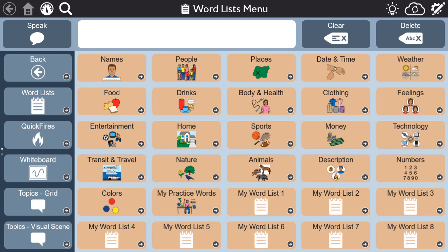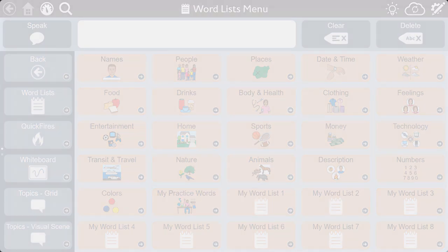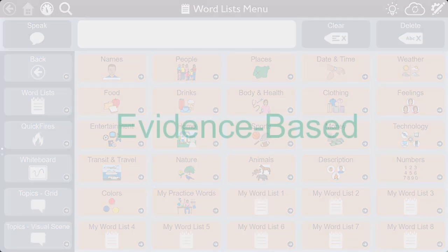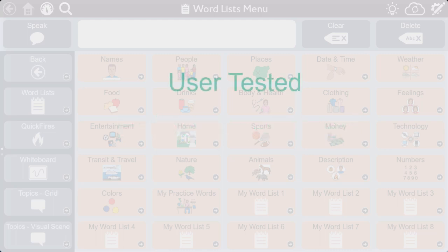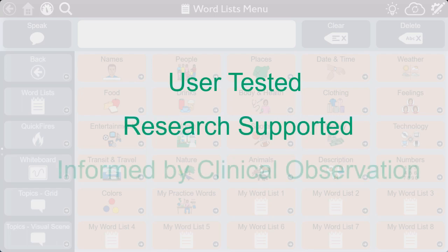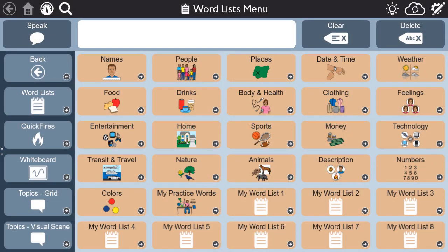Tobii Dynavox is excited to bring you the new aphasia pages as part of the Snap Core First 1.10 release. These pages contain evidence-based tools to support communication for people with aphasia. The aphasia pages were developed through testing by people with aphasia, through research, and through clinical observation. The aphasia pages provide a collection of tools designed to support communication in daily life.